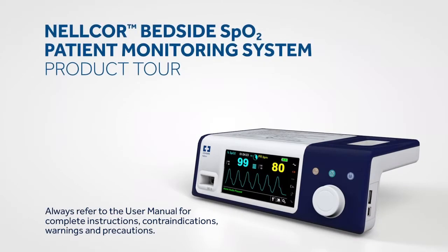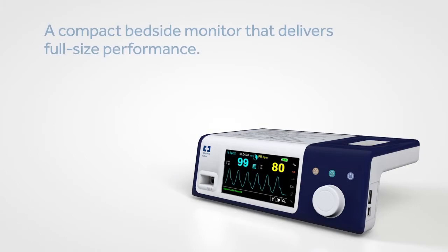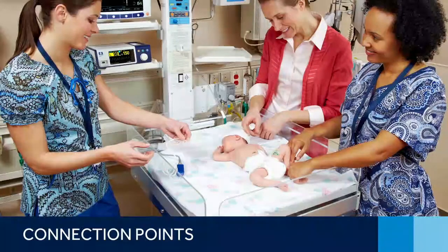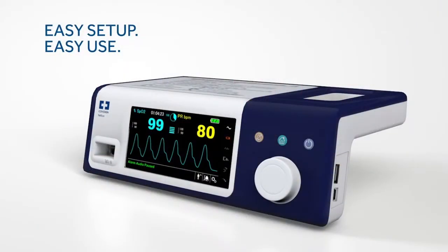The Nellcor bedside SpO2 patient monitoring system provides clinicians with access to the most critical information regarding their patient's respiratory status. The Nellcor bedside SpO2 patient monitoring system is designed for easy setup and easy use.